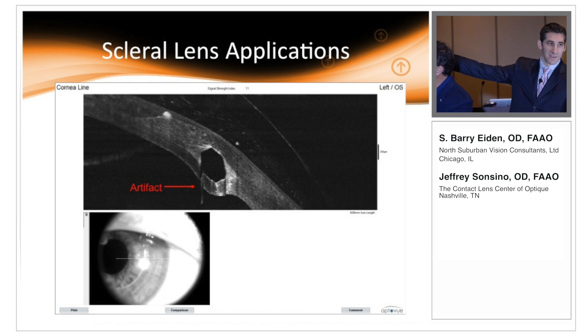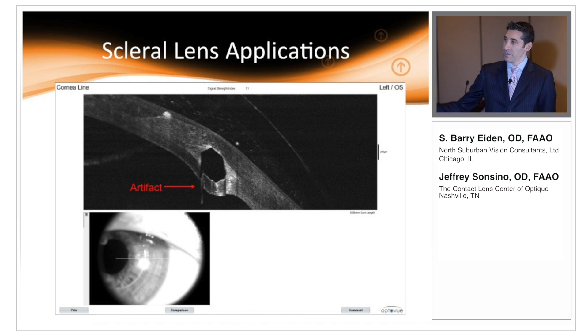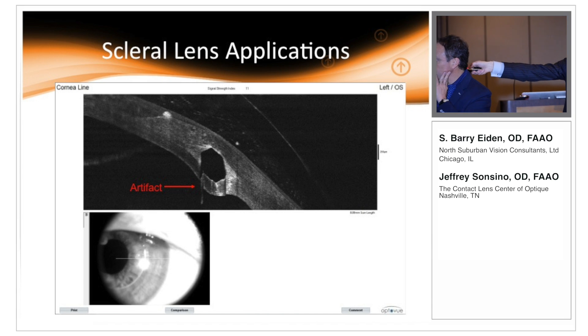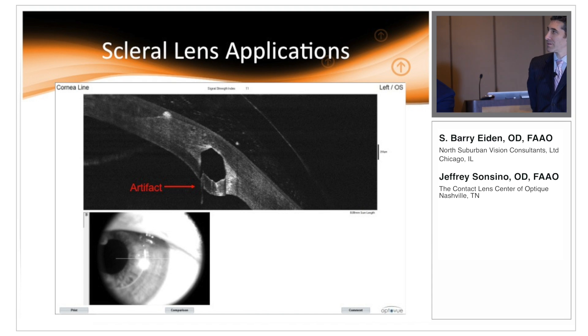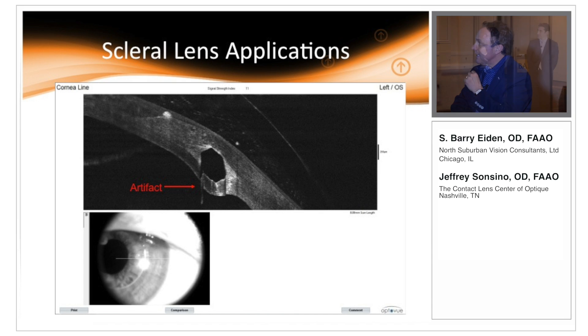If you notice, this artifact is always along the meridian that is coincident with where the LED light source is coming from, so there's some kind of internal scatter projecting it down into the anterior segment. Also, look at the orientation — this is a horizontal line scan, so this posterior detachment would be defying gravity, pointing straight into the anterior chamber. That alone tells you something is wrong with that interpretation.